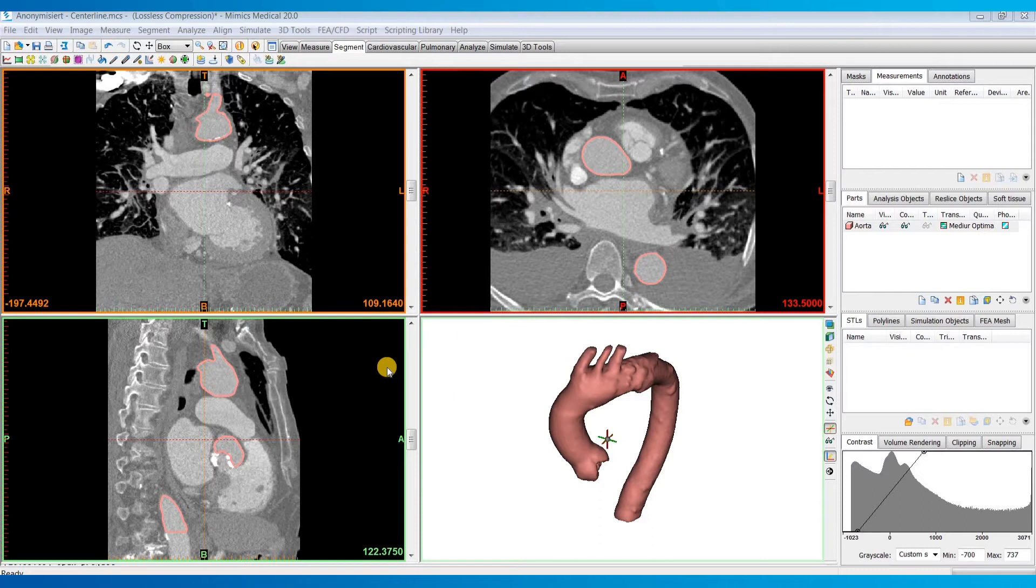Today, I'll be using an aorta model as an example. And this aorta was generated by first segmenting out the blood volume within the artery.